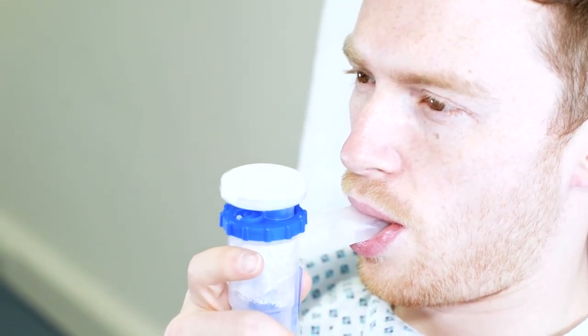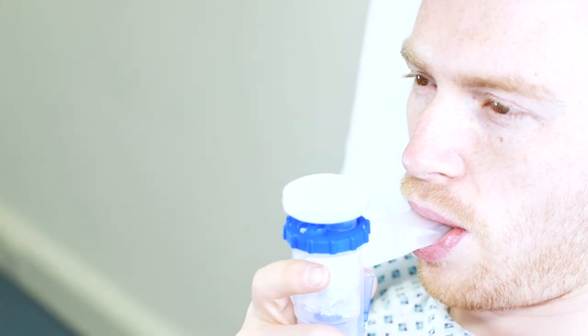Filtering the exhaled air protects the caregiver from inadvertent exposure to airborne medication. Press the trigger again to resume breathing in and medication intake.